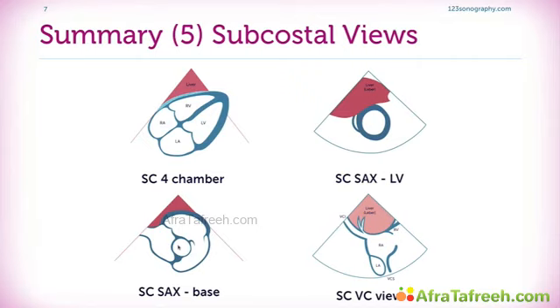The short axis view at the base with the aorta in the center. We have short axis views of the left ventricle, and we can perform a view which allows us to see the inferior vena cava as it enters the right atrium. This view is particularly helpful for the assessment of right atrial pressure and other pathologies which involve the inferior vena cava.